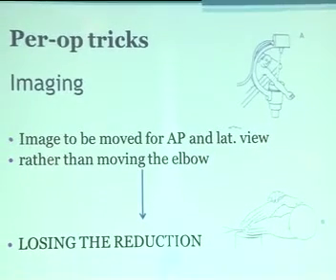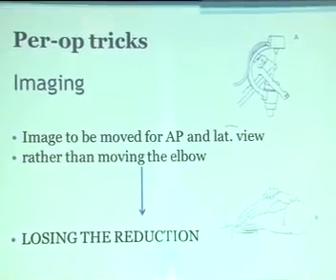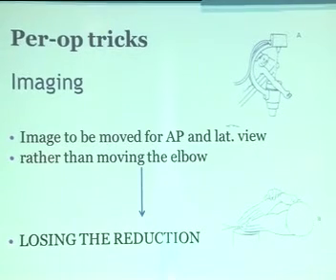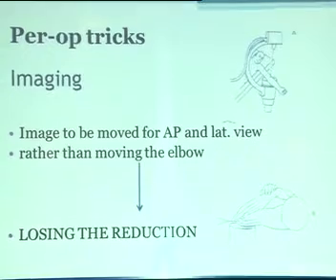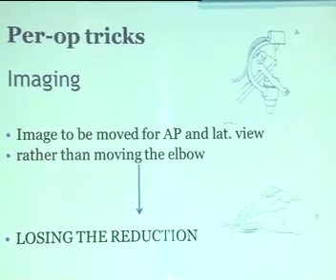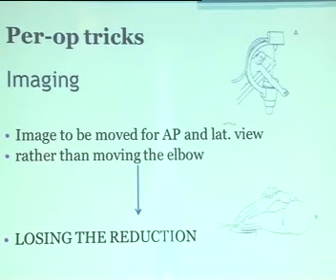So the operative trick, the points which you need to remember: the image should be moved from AP to lateral, always prefer this way. If you try to rotate the elbow and see the lateral view, many a time the reduction you feel in the AP is good, but if you turn it, you lose the reduction. So it is always better to see the lateral view by turning the C-arm.